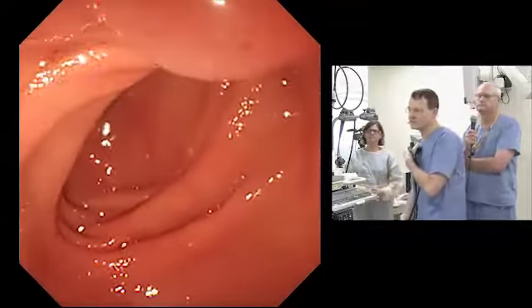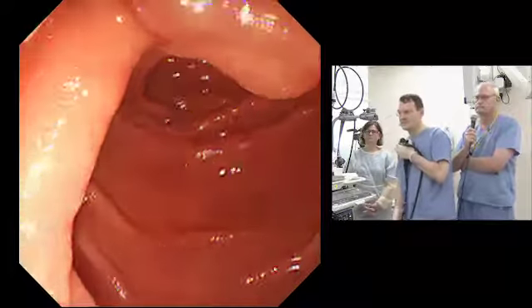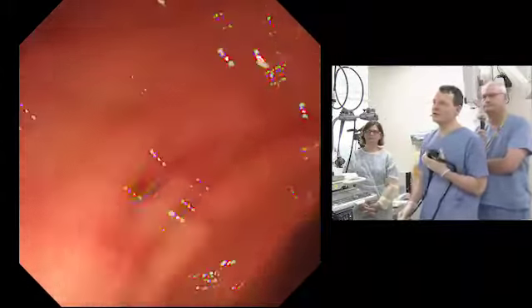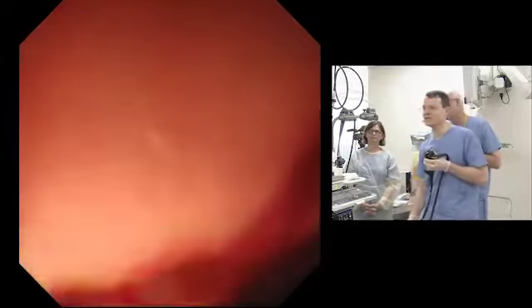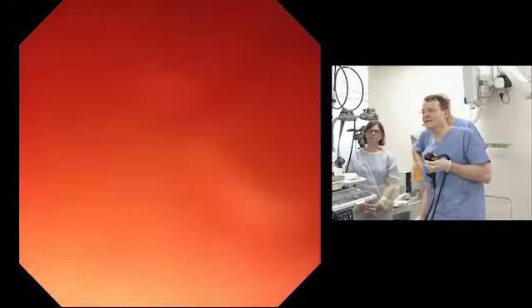This is important information. As a second step, we will now try to use EUS to get more information. This morning you heard from Rob very nicely, nobody can do this better, the explanation of how to really describe the anatomy of the pancreas.